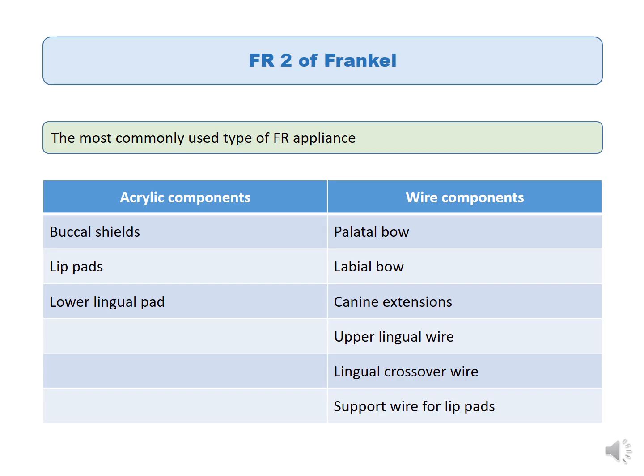Now, the function regulator 2 of Frankel is the most commonly used type of function regulator appliance. Now there are two groups of components in the appliance.